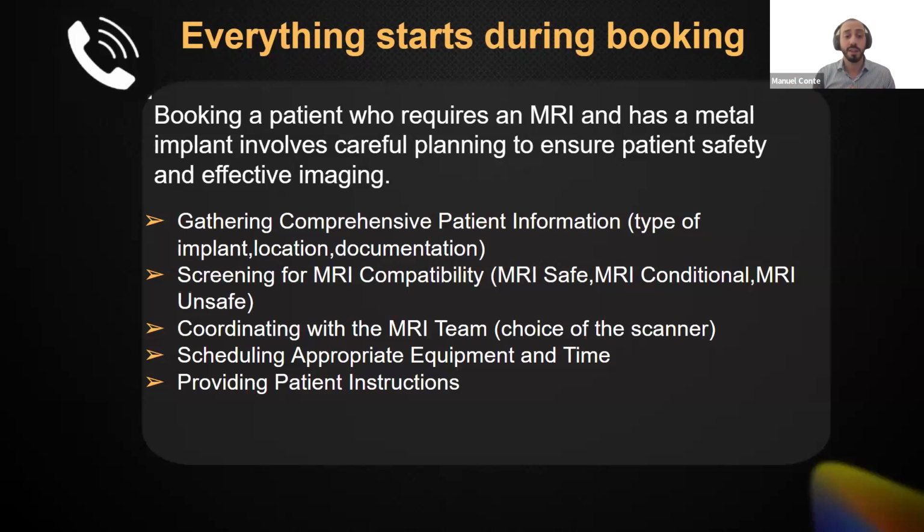And provide instructions to the patient: advise them that if they feel a warm sensation during the scan, they should squeeze the buzzer and let us know immediately.